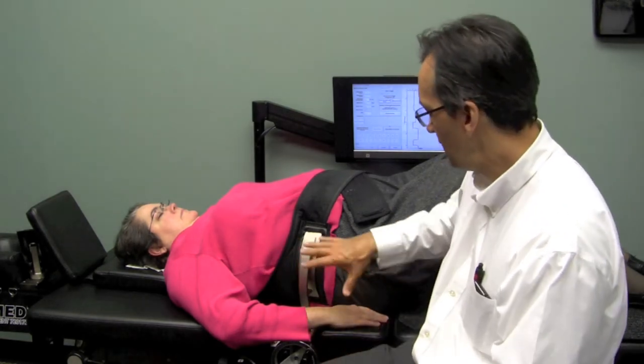The treatment table measures the tension 400 times every second — it's exceedingly exacting and sensitive. That's probably one of the reasons it seems to be more effective clinically for most patients than a conventional low-grade traction table. The concepts for the machines are similar, but the engineering is better for this table, and I think it gives patients their best chance to improve from a traction or decompressive treatment.